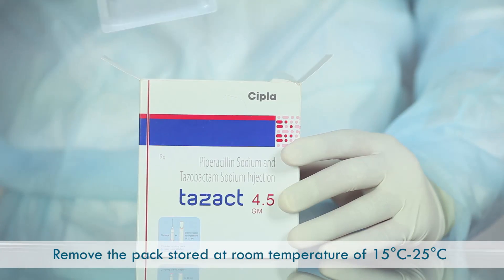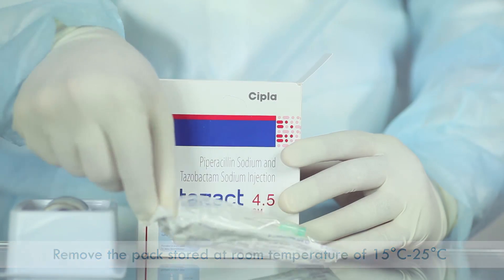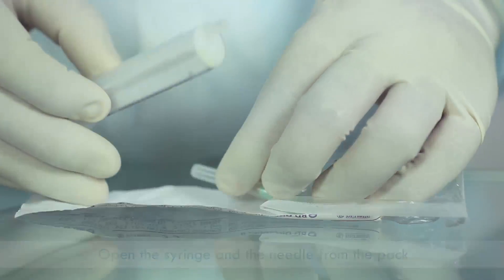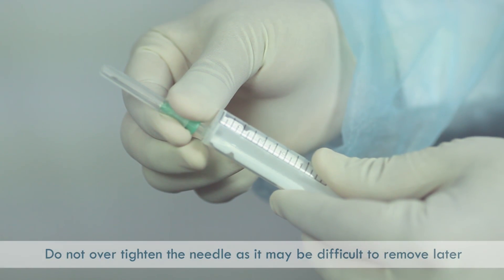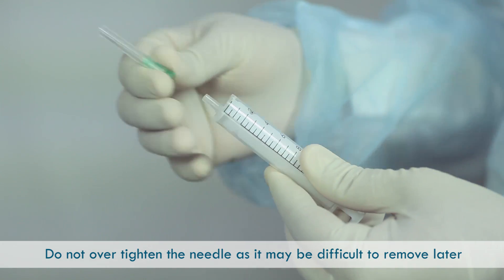Remove the pack stored at room temperature of 15 to 25 degrees Celsius. Open the syringe and the needle from the pack. Fix the needle on the syringe. Do not over-tighten the needle, as it may be difficult to remove later.